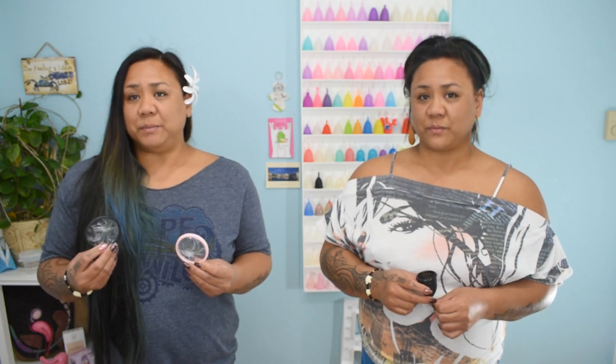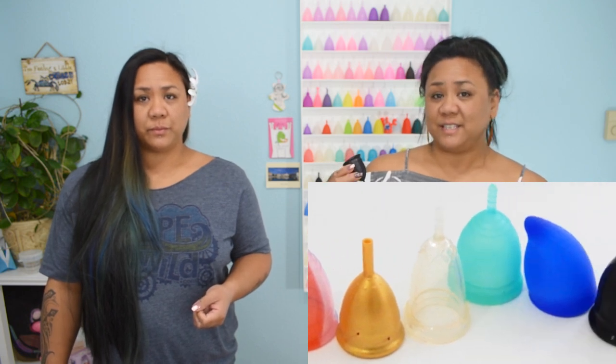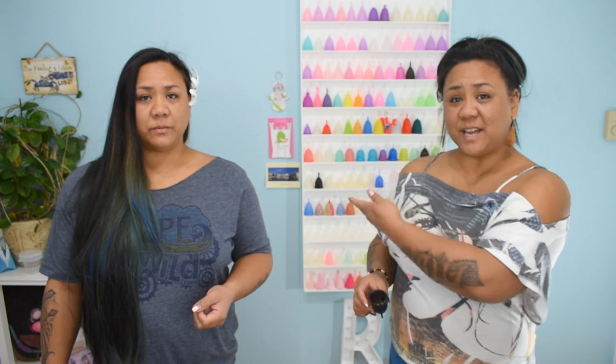A menstrual cup is bell or funnel shaped and is usually made out of silicone. You can also find them made out of TPE, and at least one that is made out of gum rubber. A menstrual disc, like the Soft Cup or the Flex Cup, is made out of a polymer blend and is more shaped like a diaphragm. A menstrual cup comes in several different shapes, sizes, diameters, firmness, and even colors.